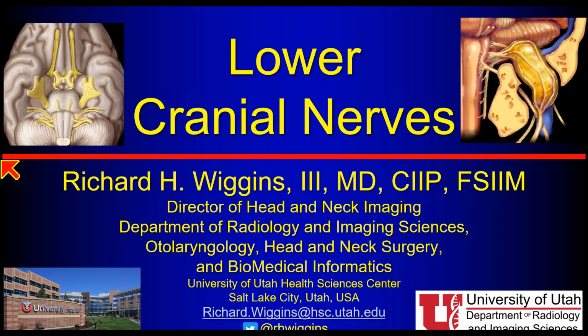Because I want to see those mastoid air cells so well, I've actually moved away from doing an MR. For my patients with pulsatile tinnitus, I'm now doing a CTV phase temporal bone CT study. And I've actually been doing either pulsatile or non-pulsatile tinnitus cases. So anybody with tinnitus that comes to my shop, I've been doing a CTV, a venous phase temporal bone CT with thin axial and coronal bone algorithm sections to try to see all that anatomy as best I can.